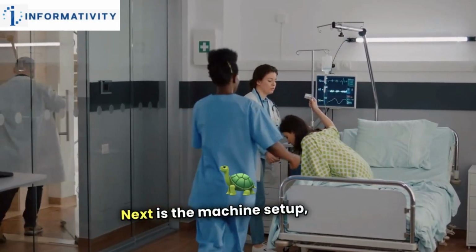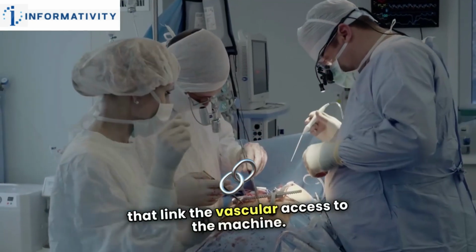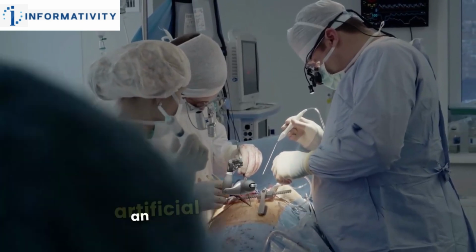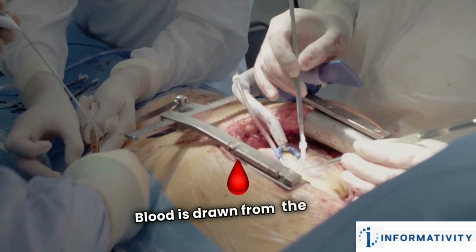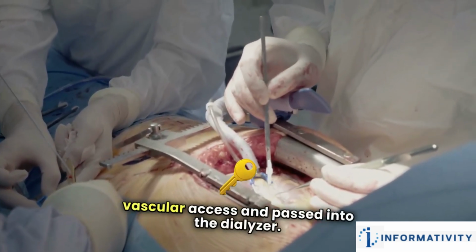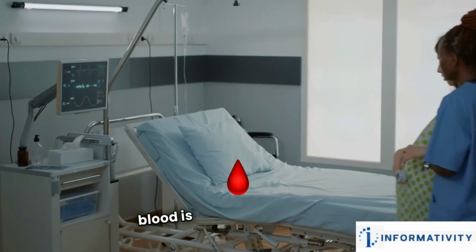Next is the machine setup, where the patient is connected to a hemodialysis machine using tubes that link the vascular access to the machine. The machine has a dialyzer, also known as an artificial kidney, that filters the blood. During the dialysis process, blood is drawn from the body through the vascular access and passed into the dialyzer. The dialyzer removes waste, toxins, and excess fluid from the blood, and the clean blood is then returned to the body.